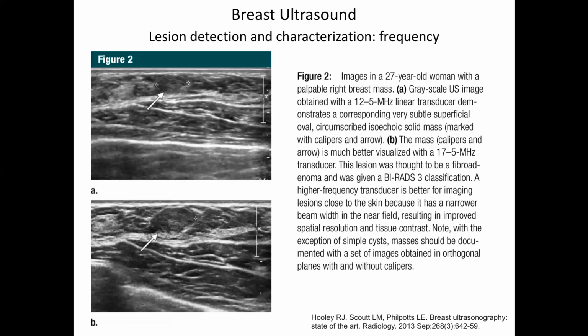When the application's at the surface or not too deep, you can, because as you can see, the resolution falls away pretty fast as we get down into here.